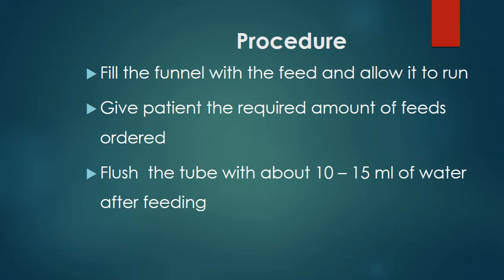Then, with this, I would like to explain that there are actually two ways by which we can give NG tube feeding. So do not be surprised when you move from one hospital to the other and you see that the ways by which they are giving the food appear to be different. We have two main ones. Even, let me say there are three, but the third one is not common within our setting. So I will focus basically on the two.